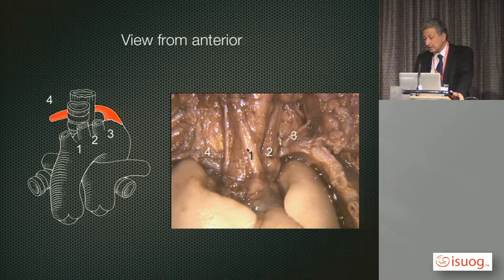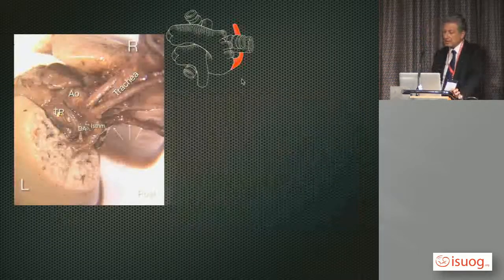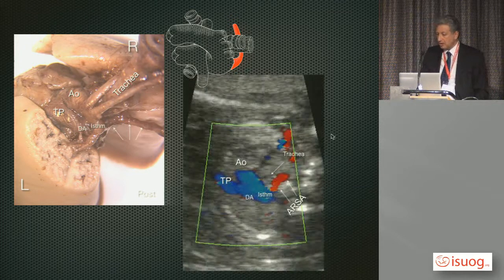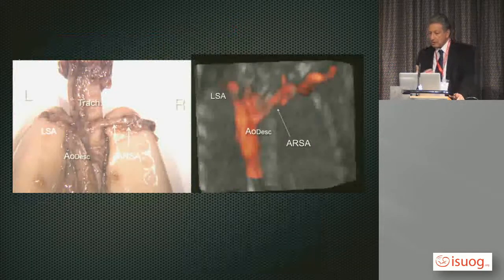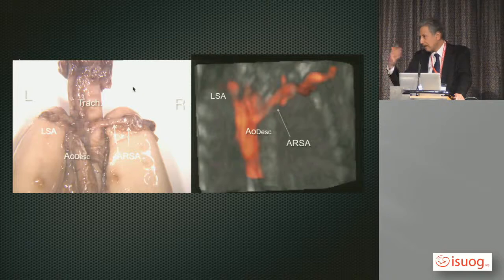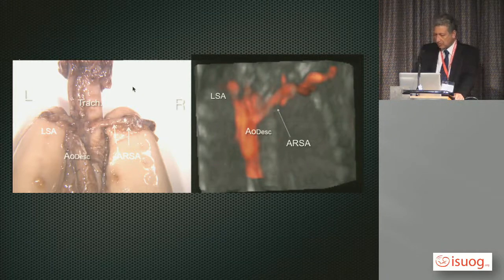And she told me that in this region, you should see the bifurcation toward the clavicle, but this vessel is behind. Then we removed this package, and I said, I want exactly the plane I was seeing in ultrasound. And we did the 3-vessel view with the trachea here, and I put the aberrant subclavian on the right side, and this is the left subclavian artery. And then I tried to get exactly the same images, because I said, well, it's an interesting case report on a rare anomaly. Probably no one had seen this with this combination at that time.